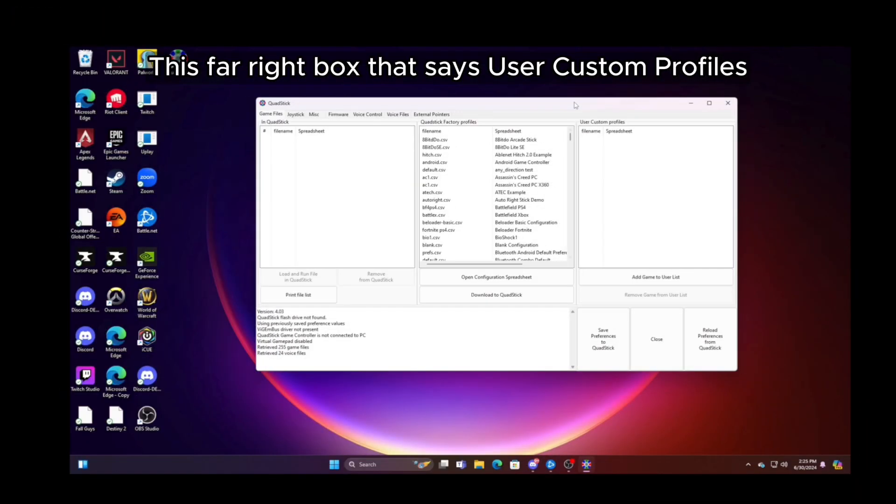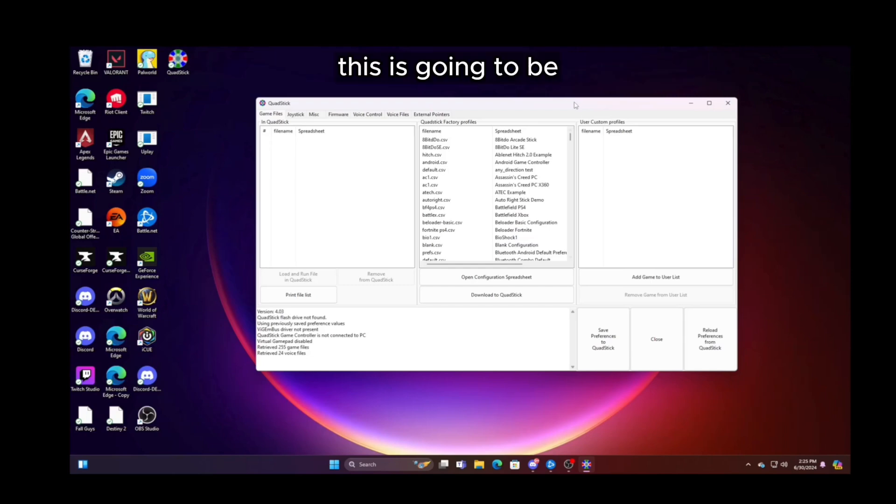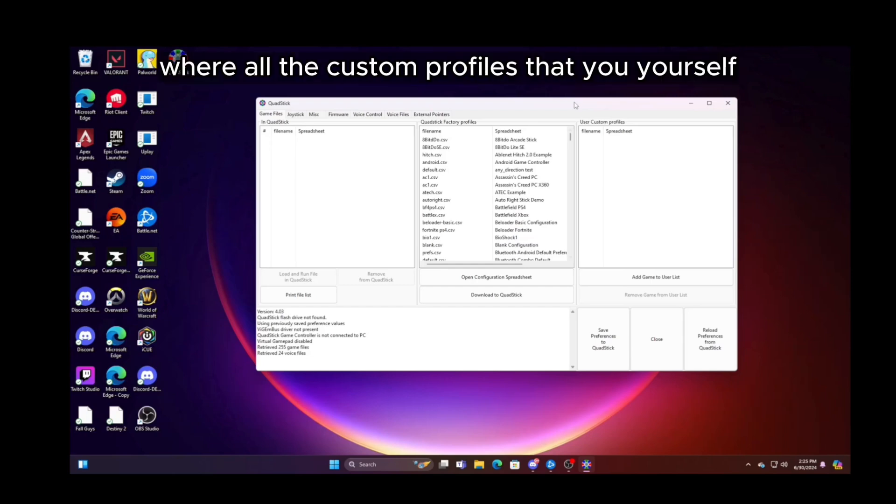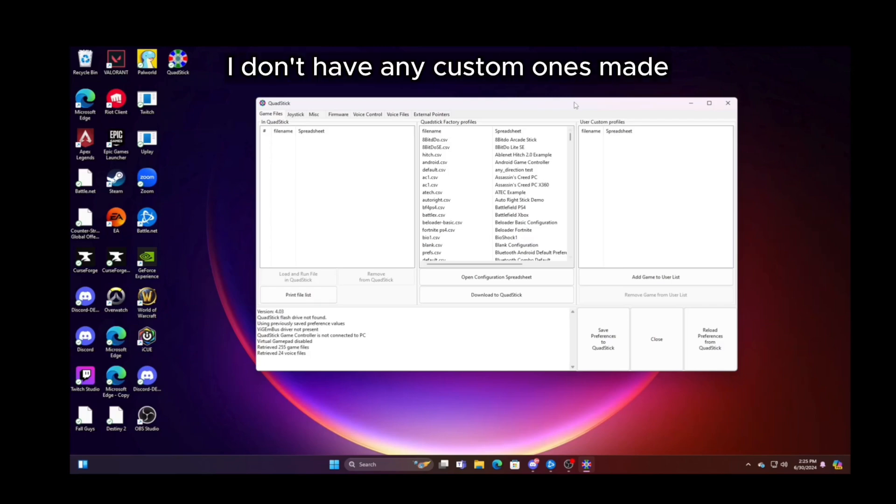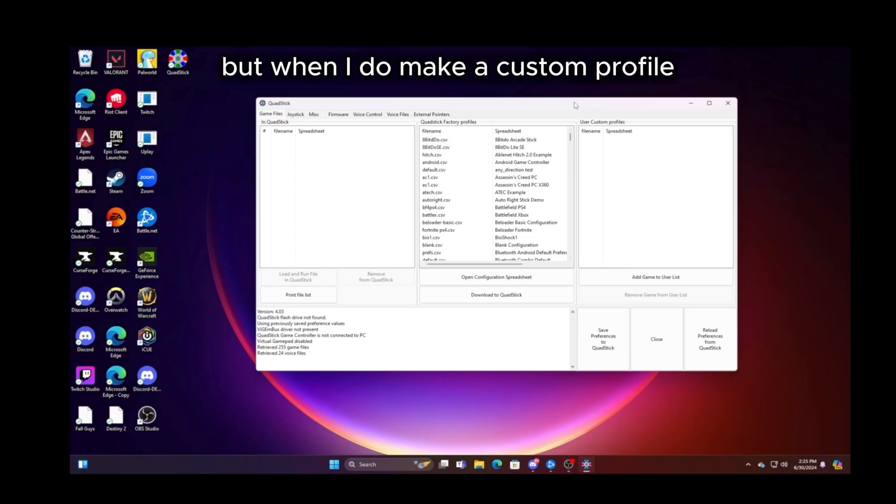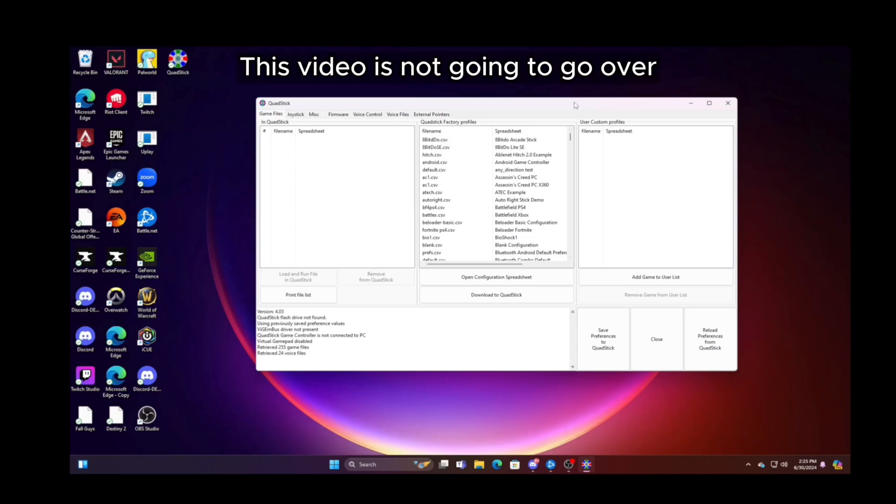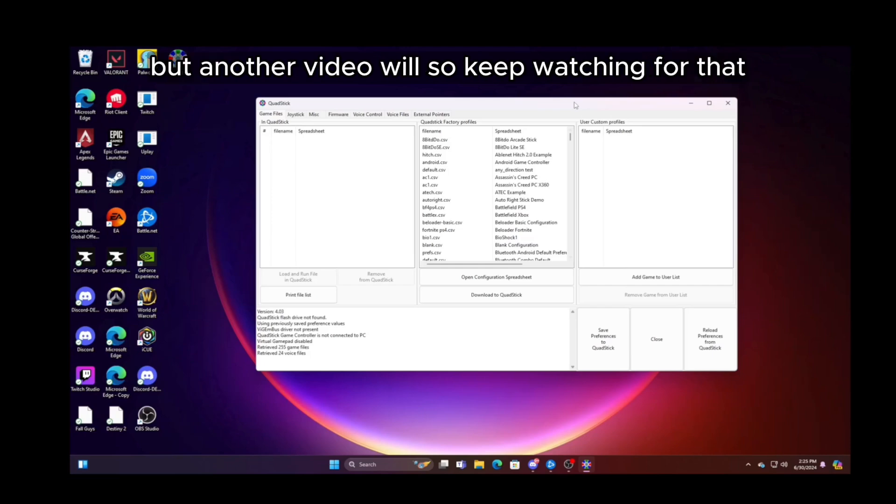This far right box that says user custom profiles, this is going to be where all the custom profiles that you yourself would make are going to be stored. Right now on my home PC, I don't have any custom ones made. They are all at the clinic so far. But when I do make a custom profile, it will be saved here. This video is not going to go over how to make those custom profiles, but another video will. So keep watching for that.